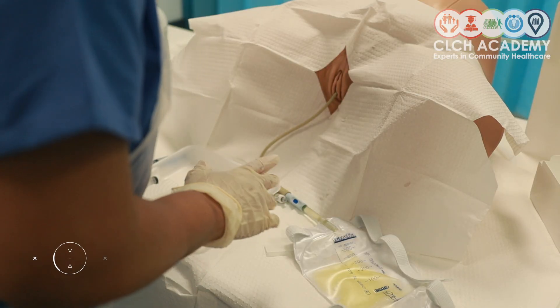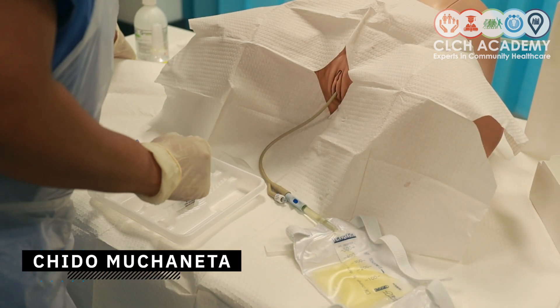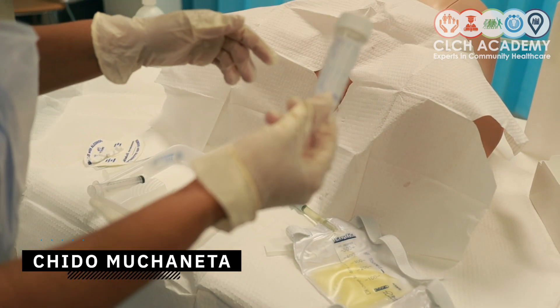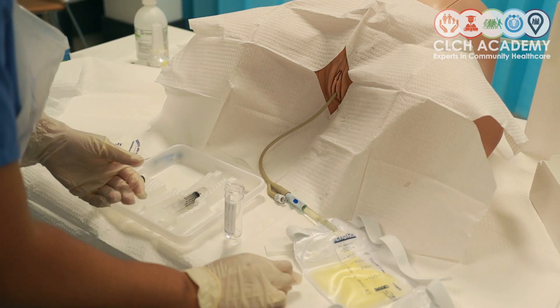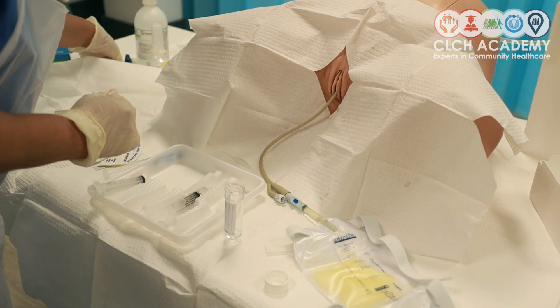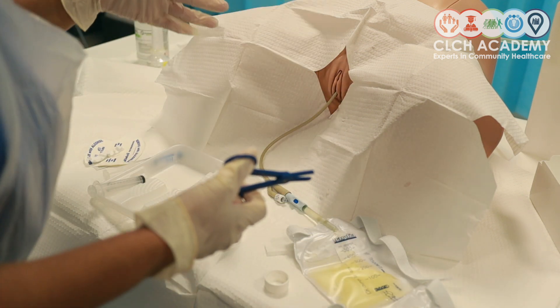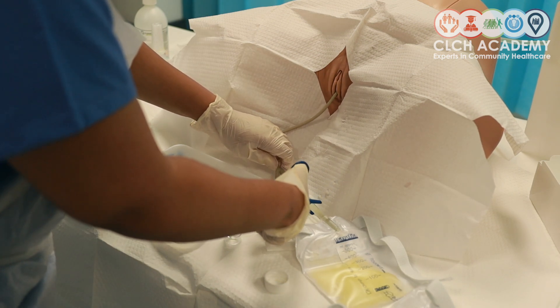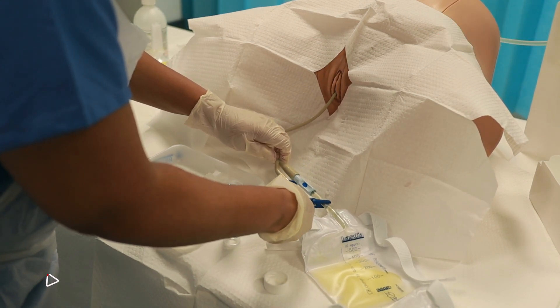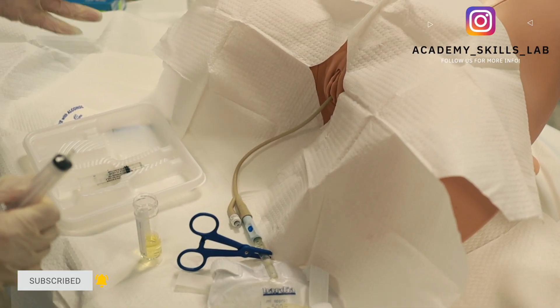To collect a urine sample, I'd obviously need my sample bottle and I'm also going to need a clamp. The idea is not to collect the sample from the urine within the bag, but to collect the sample that is flowing through the catheter directly from the bladder. So I would clamp just before the bag.